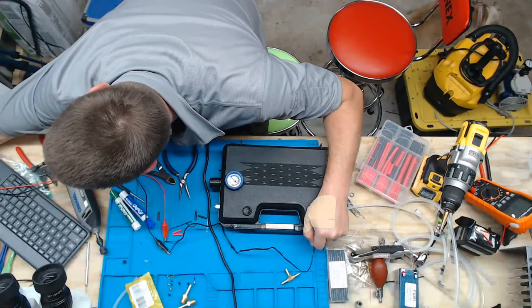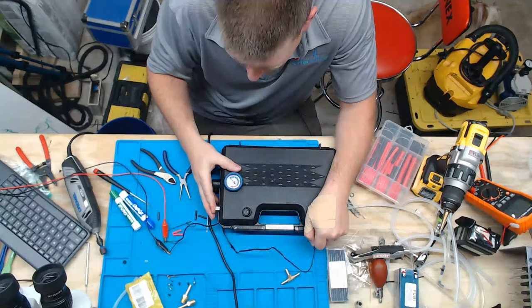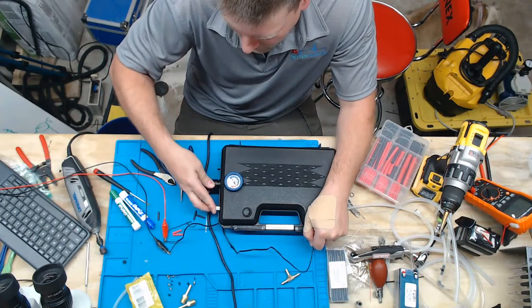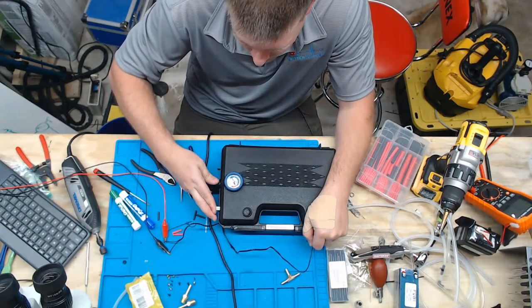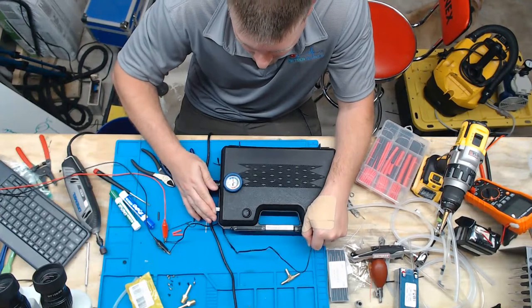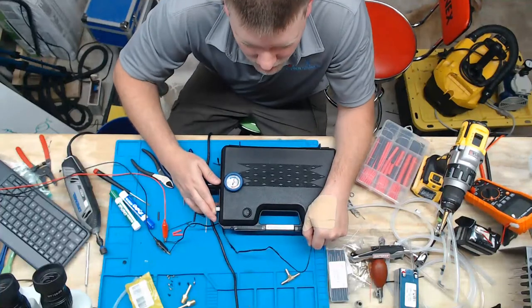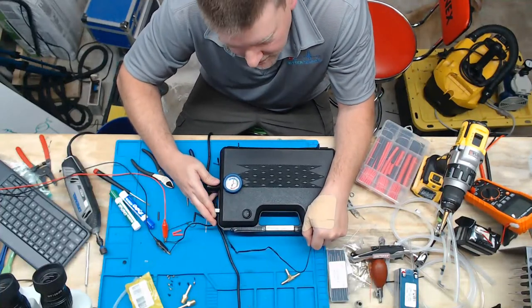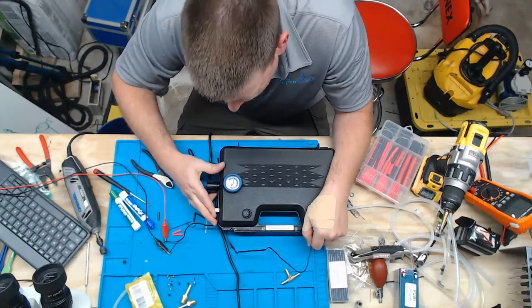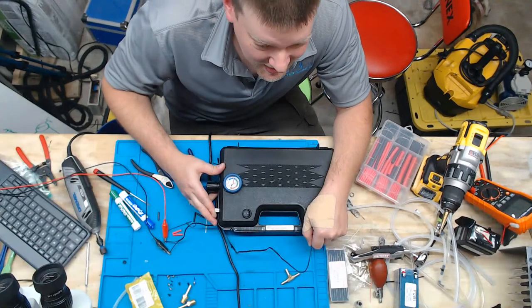Okay, let's up the voltage a little bit. There we go. Okay, you guys can see the little analog gauge right there doing its thing. Regulate the pressure. See, that's the resolution that we need. You see how I'm going up and up and up like that? And I have to spin it quite a few times? That's resolution. You have to have that, because if it's really fine, you're going to go back and forth over the set pressure that you're looking for. So right now, this guy is sitting at, what, 22 PSI, according to this thing?